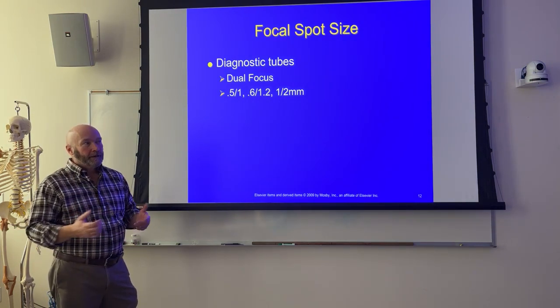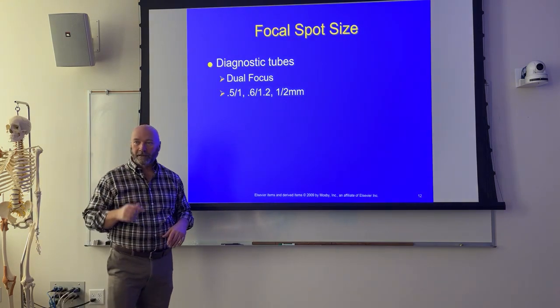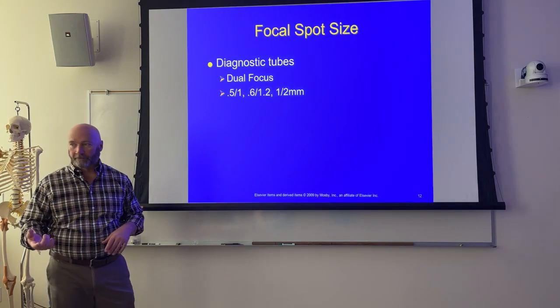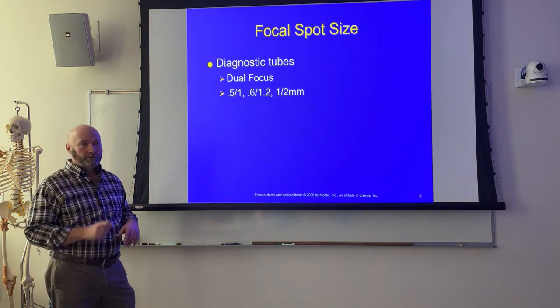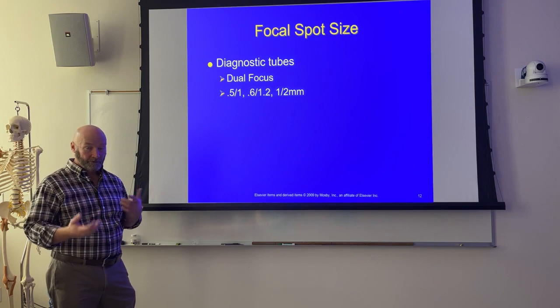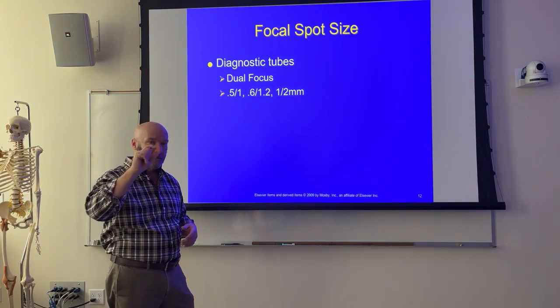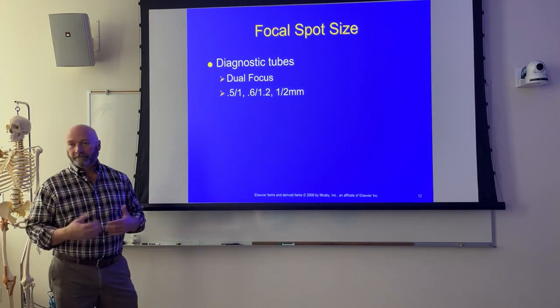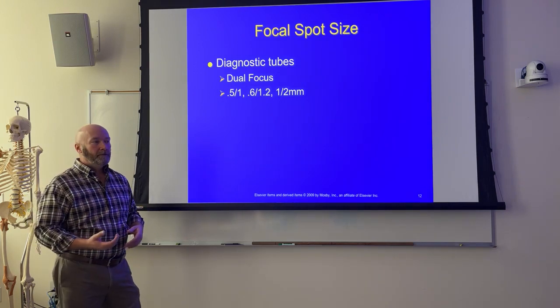So try this in clinicals. Go push the button for a hand X-ray, and then take your MA and roll your MA up to like 600 MA if it'll go up that high. If it's still on small focal spot, it won't let you even rotor up because you're going to potentially damage the X-ray tube. You put that many electrons on that little bitty focal spot, and it's going to say, no, you're going to cause some damage here. So it won't let you do it.